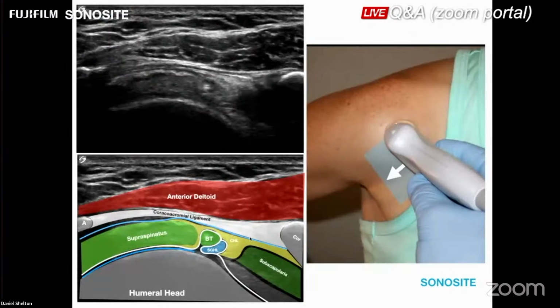Now let's colorize these structures, and I've got part of the transducer on the coracoid and the other part of the transducer on the acromion process, and this makes up our transducer placement for the proximal supraspinatus. So this is where the musculotendinous junction is, and we can see the central tendon of the supraspinatus and the muscle fibers following of the very proximal edge of what we consider to be something to look at. But here's your coracoacromial ligament. If it's dipping or sagging, we've got volume loss, and that's something to look for here.